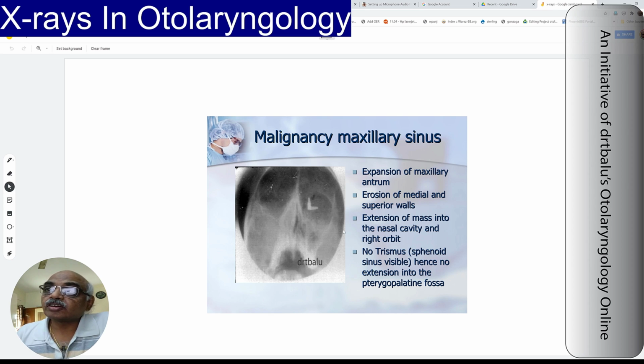And another common question which the examiner, the old timers, used to ask by just projecting these X-rays: can you tell me whether the pterygoids are involved in this patient? Since it's a malignancy, involvement of pterygoids is one important aspect which you should consider before you manage the patient. Whenever there is involvement of pterygoid by malignant tissue, it will cause the patient to have trismus. Difficulty in opening the mouth is known as trismus, and patients with erosion of the pterygoid plate or involvement of the pterygoid musculature will have trismus and will not be able to open the mouth.